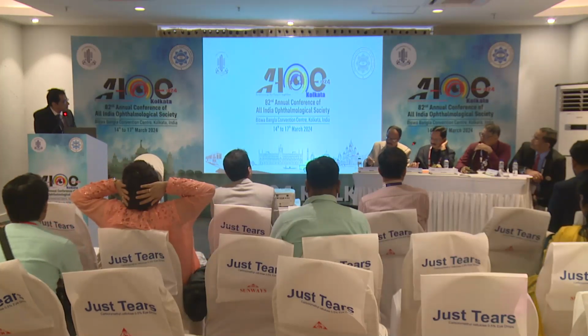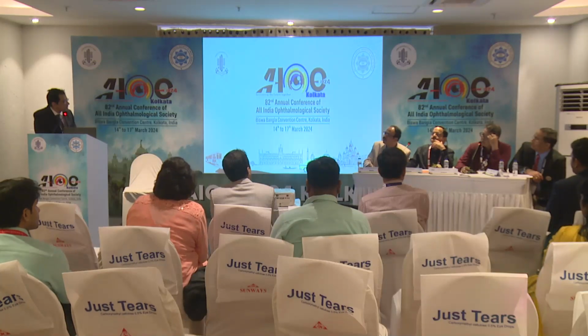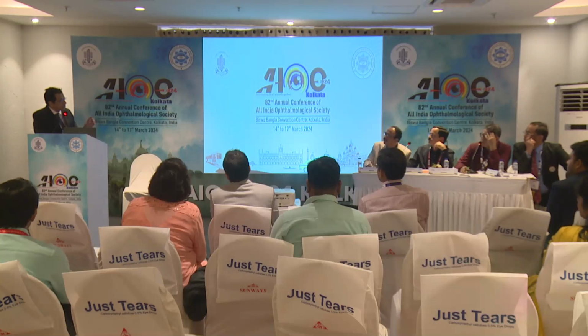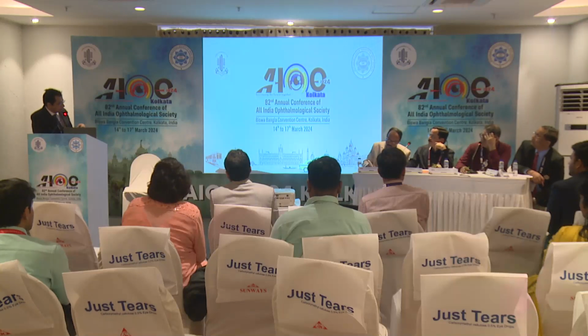Which quadrant did you choose for that suprachoroidal tap? This was not a suprachoroidal tap, sir. It was just a pars plana tap. In which quadrant? It was in the superotemporal quadrant. I was sitting in the temporal. All these incisions were temporal. I just chose the area behind it, superotemporal.